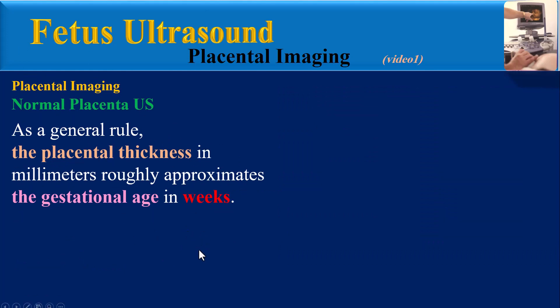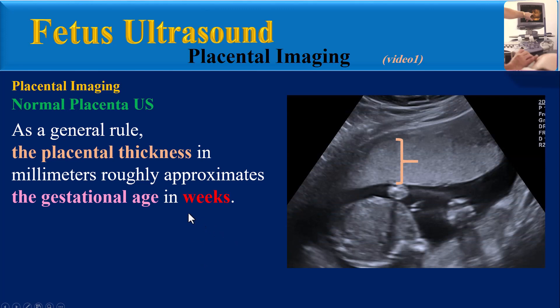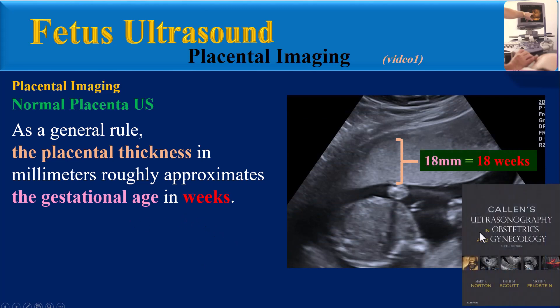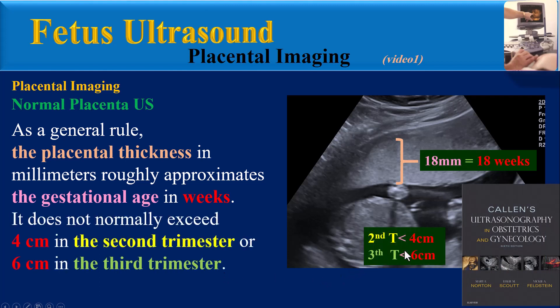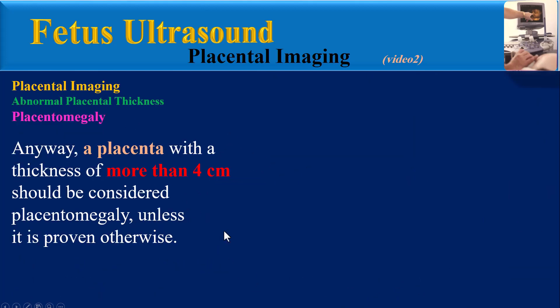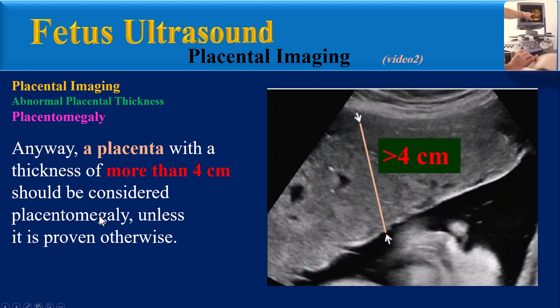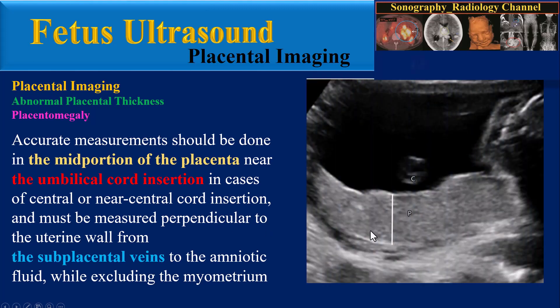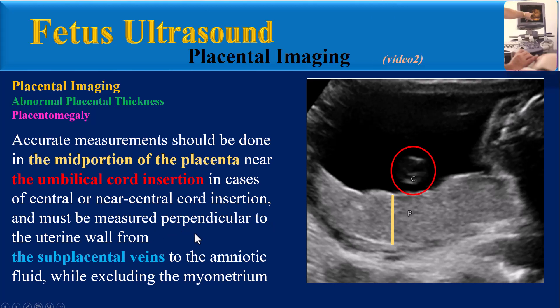Regarding abnormal placental thickness, as a general rule the placental thickness in millimeters roughly approximates the gestational age in weeks. One reference suggests it does not normally exceed 4 cm in the second trimester or 6 cm in the third trimester, though many articles suggest it should not exceed 4 cm. A placenta with a thickness of more than 4 cm should be considered placentomegaly unless proven otherwise. Accurate measurements should be done at the mid-portion of the placenta near the umbilical cord insertion and measured perpendicular to the uterine wall from the subplacental veins to the amniotic fluid, excluding the myometrium.